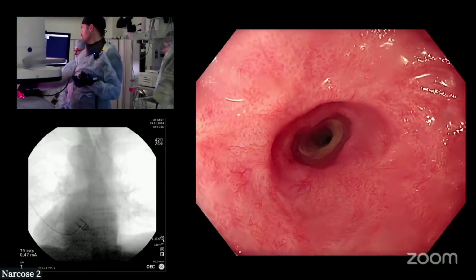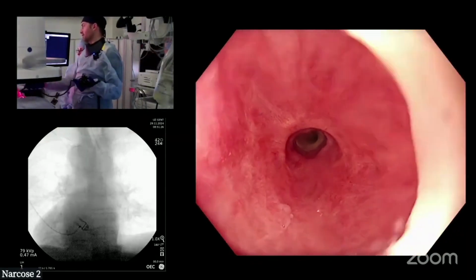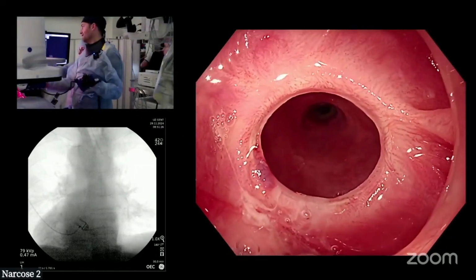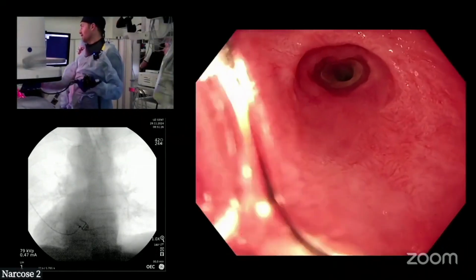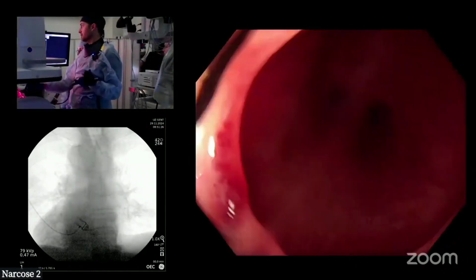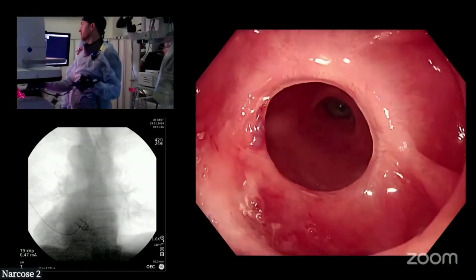How much pressure should you apply? I think that's an experience thing. It's very, very hard to deconstruct that. And you can see that we have had some impact on it. We made it wider. And probably I can pass this, but let's just go back to the discussion about incisional therapy for a second, because I think it's something which you don't often get a chance to show.